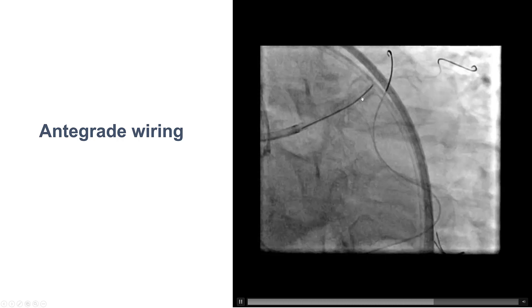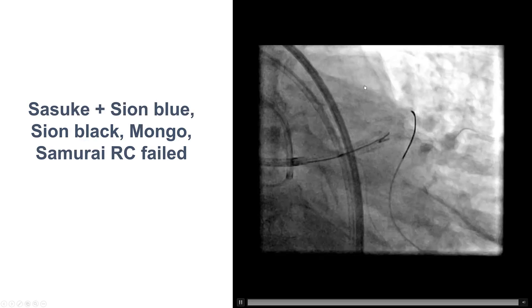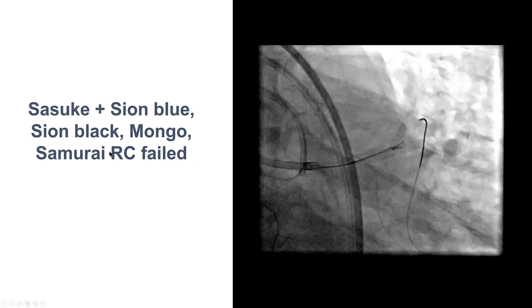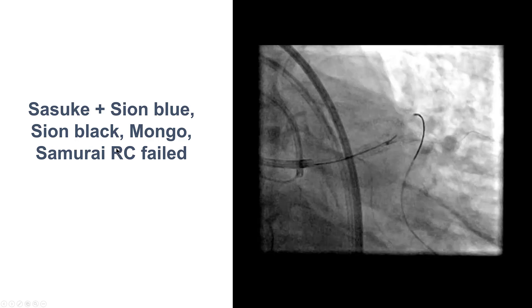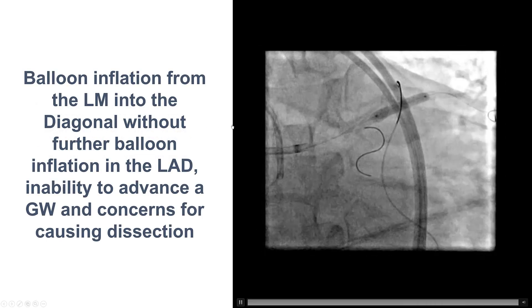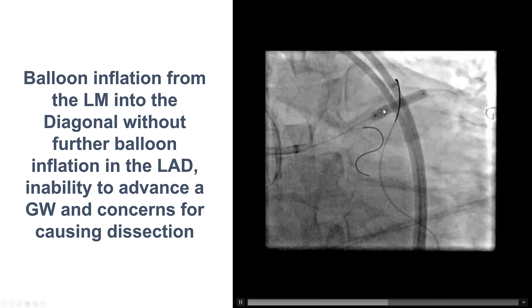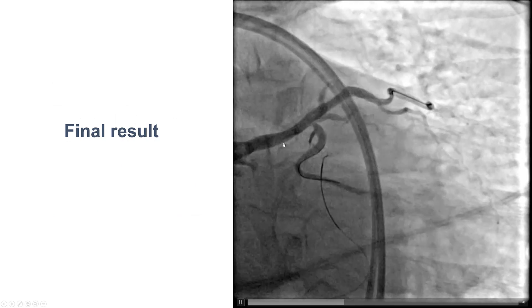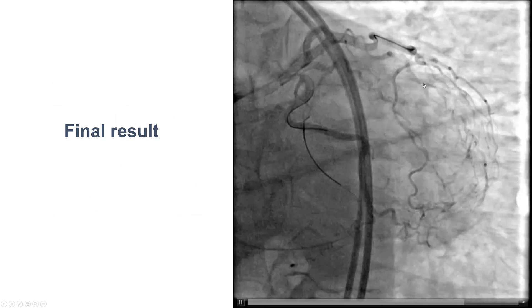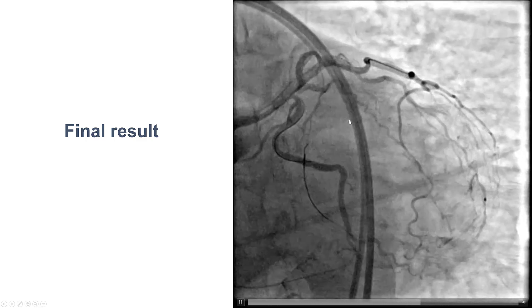Multiple attempts in the caudal view trying to advance an antegrade wire into the LAD were unfortunately not successful, using multiple guidewires and multiple microcatheters including a dual-lumen microcatheter. Eventually, after multiple attempts, we gave up. We performed balloon inflation only into the main vessel — from the left main into the diagonal branch. The final result showed good flow into the very large diagonal branch, but suboptimal flow into the LAD.